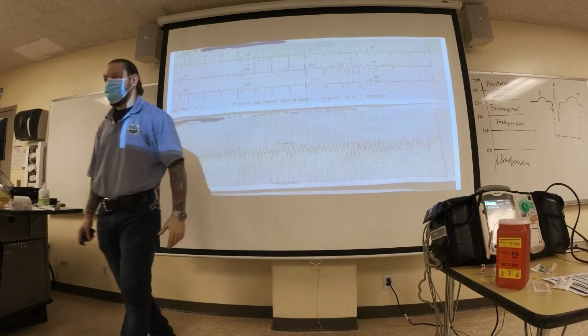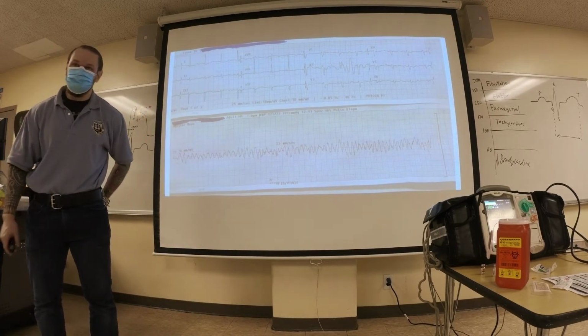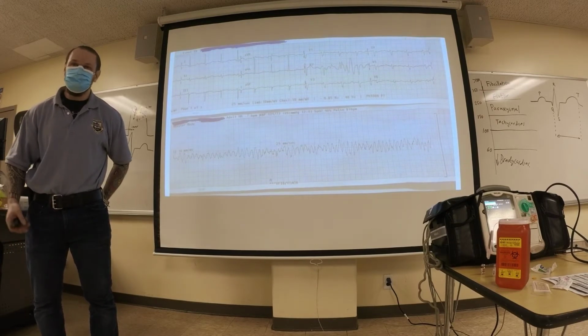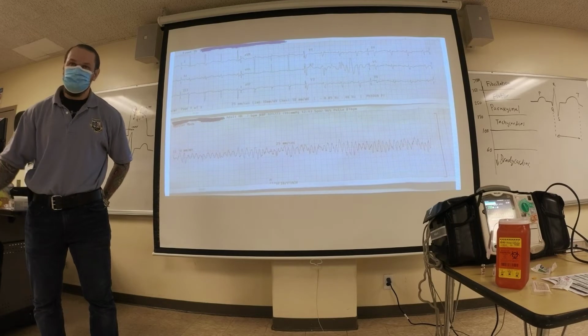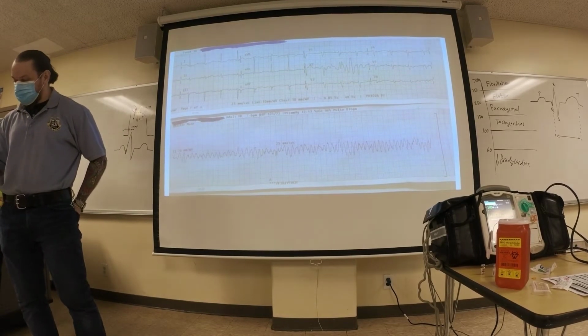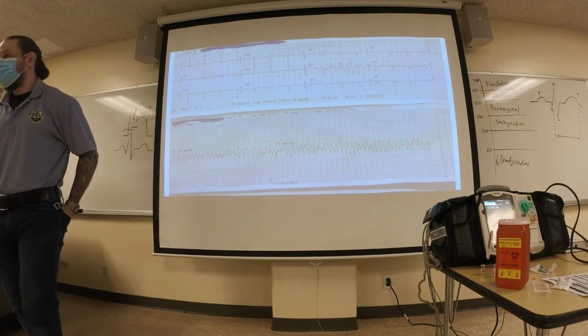You may get a call about an alcoholic, someone lying in front of the building. You come talk to him, he's not alert and oriented, you can't really communicate with him. You put him in the ambulance, and one of your partners decides to do an EKG. Oh, you've got a student on board, and they put him on the monitor. What are you going to do now?